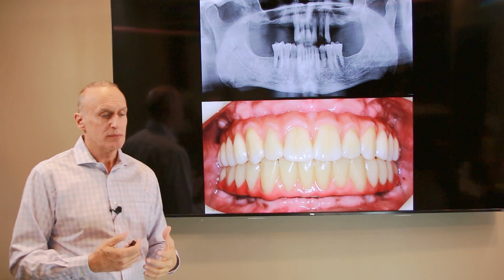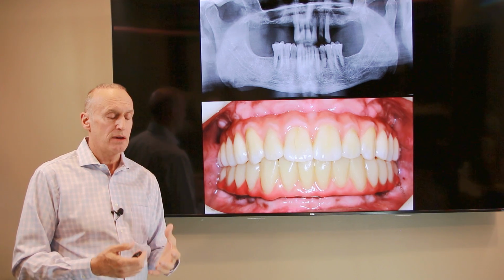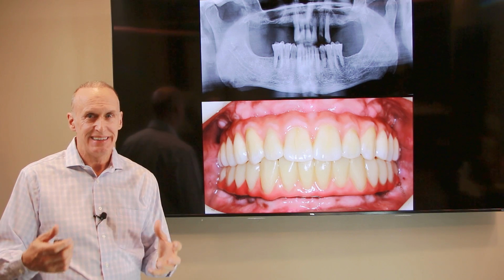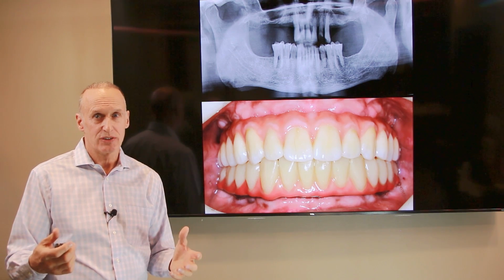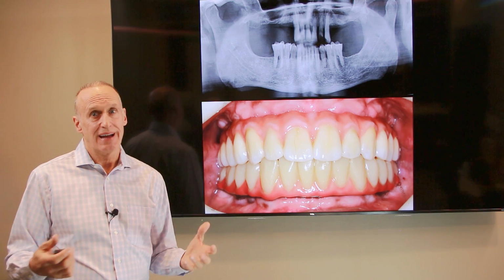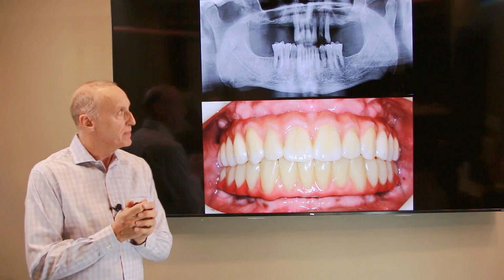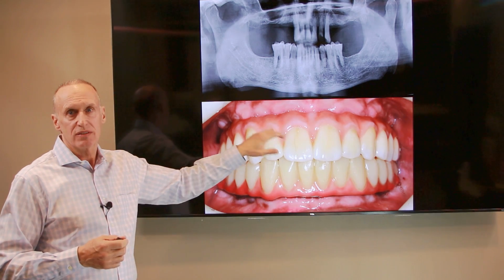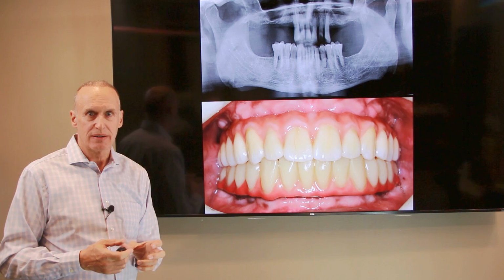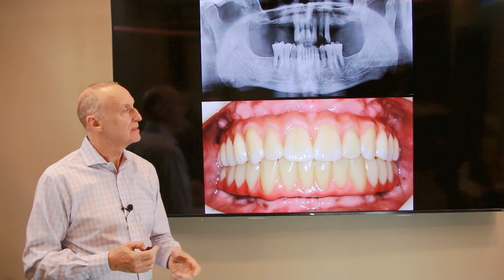Again, there are some techniques that we can use to build bone back where it doesn't exist, but you can't have any teeth in your mouth, including a denture, for more than 6 months. So that's a deal breaker for 99.9% of our patients. But again, I want to reiterate, the way this bridge fits with the pink is the exact same way it fits without the pink. It's clean, it's hygienic, and it's convex.